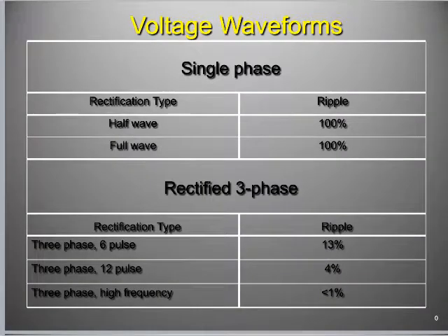Before we jump into the activity, though, I do want to talk about waveforms. And if there's a section where there's a tendency for students to glaze over, this is probably it. The circuit stuff, I feel like that's a real thing. I can pass around stuff. This stuff is weird. And what it's dealing with is what we've learned in terms of waveforms, that alternating current is dealing with a waveform. So if we look on page 122 in our textbook, we're going to start using the textbook more. I'm going to walk you through it with the textbook, and then we'll look at a diagram.